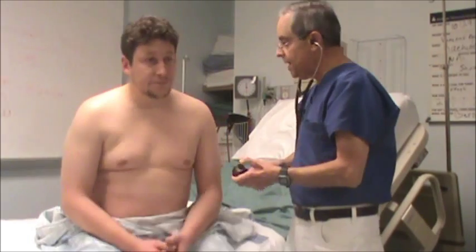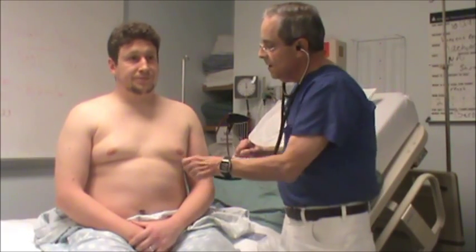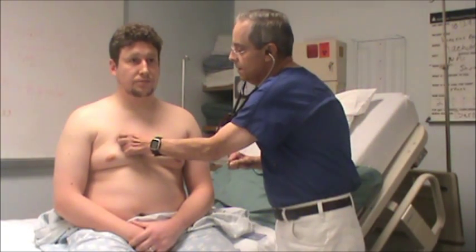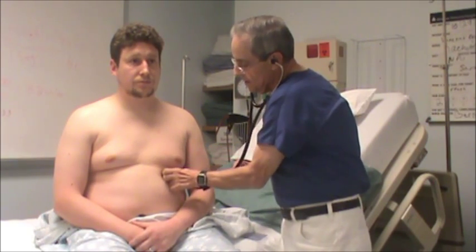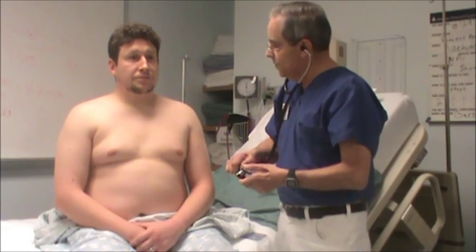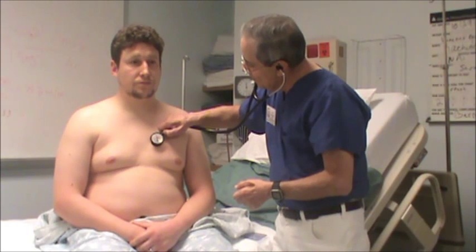If you can sit up for me. And if you could take a deep breath in, let it out, and hold it. And then do an auscultation. Okay, breathe. That one has to be rather quick. And breathe in and hold out. And now we're going to do it with the bell.